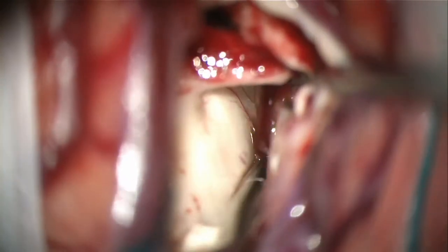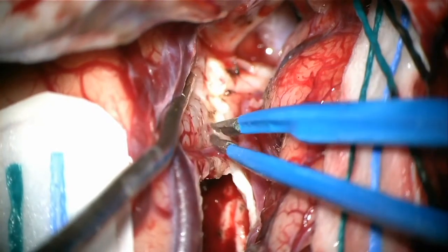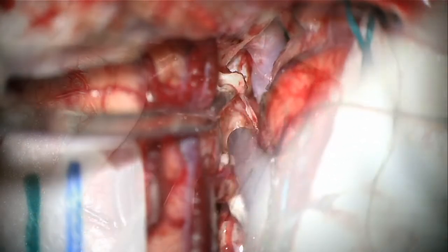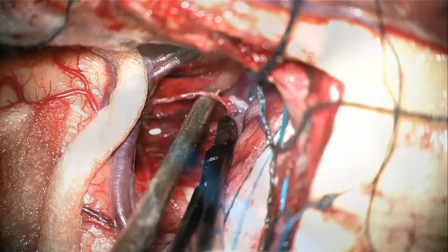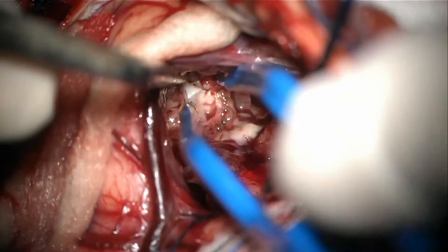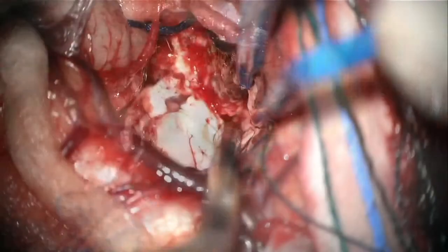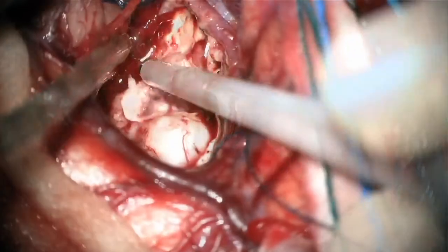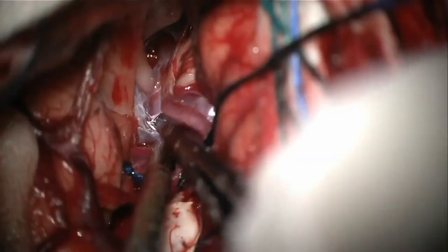I am looking now medial to find the choroid plexus and the choroidal fissure. This has been done through an inferior insular sulcus approach, but I now continue debulking the uncus and liberating this early temporal branch from the MCA. And now I proceed with the lateral disconnection of the hippocampus from the rhinal sulcus to the collateral sulcus. This is the anterior disconnection from the amygdala, for which I am using the ultrasonic aspirator.